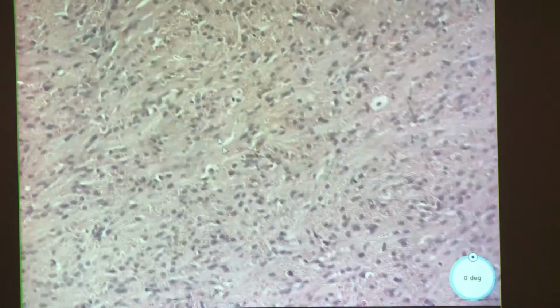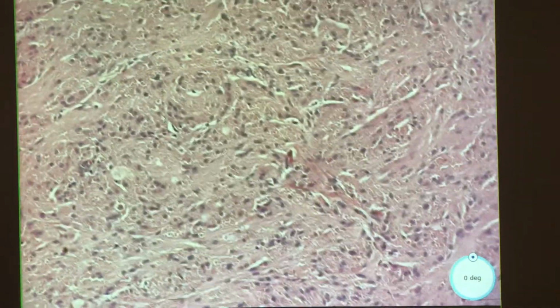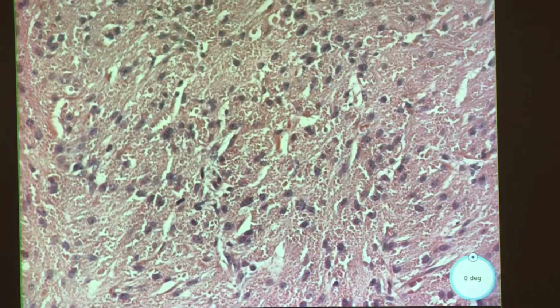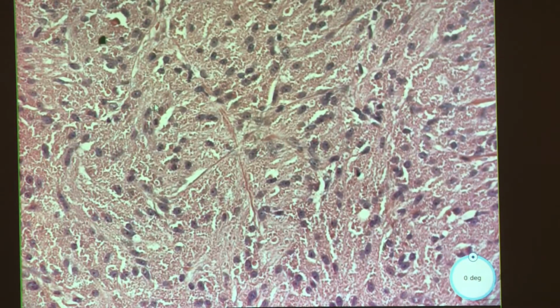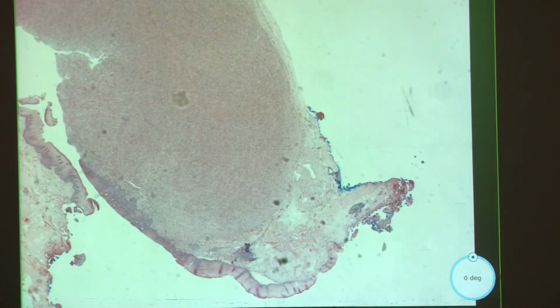It's very cellular, very low N/C ratio, lots of cytoplasm. The cells almost look epithelioid, sort of. And it looks kind of granular. Yeah. No, it's definitely granular. The edges, it sort of has an edge, but it's not that well circumscribed.